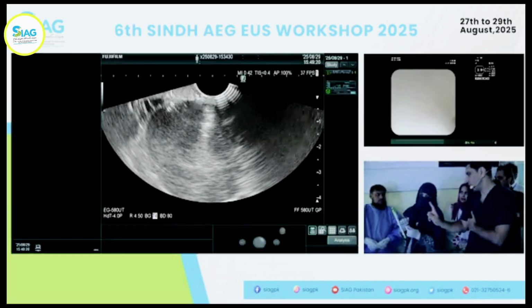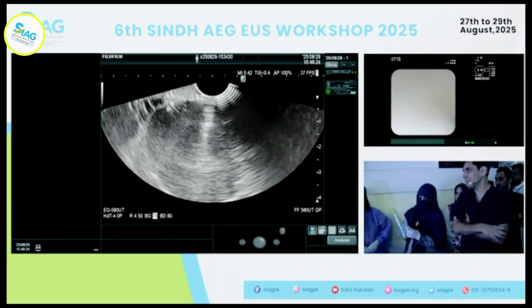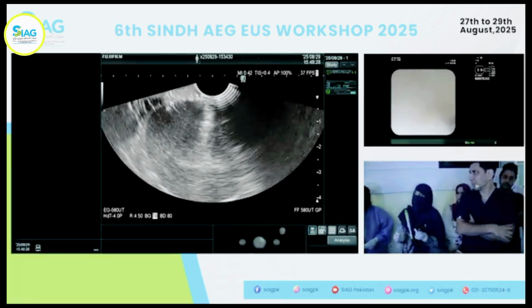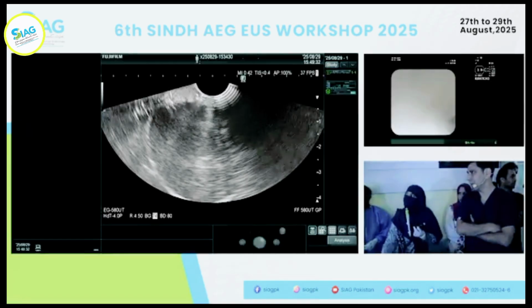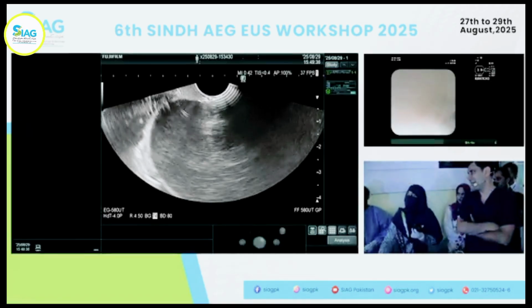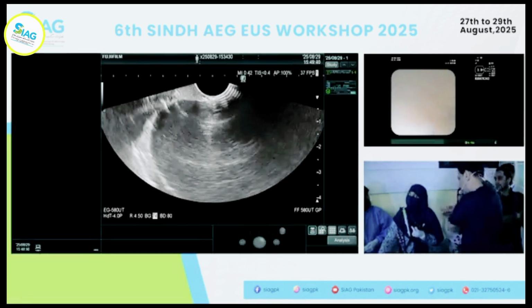So before you go on, again, as Dr. Sadnaz was doing with Shah, move your shoulders, see if you can improve your visualization. Good. Keep going to the left. Good. Advance the scope a little. First class, right? Good. That air, if you can get rid of that air, somehow or the other, it should help. अच्छा, एक और चीज जो होती है, it's a very common mistake.